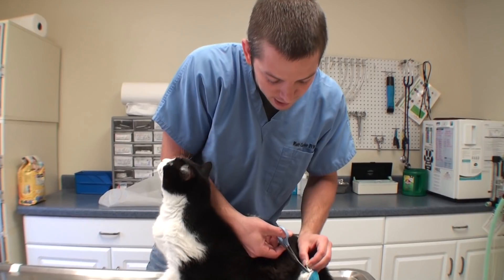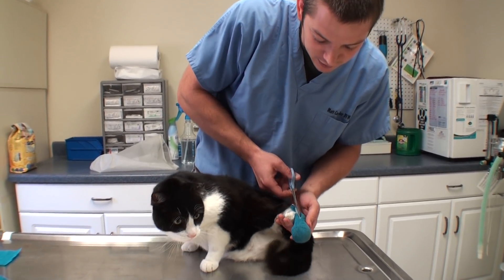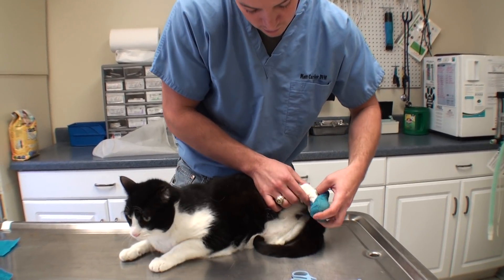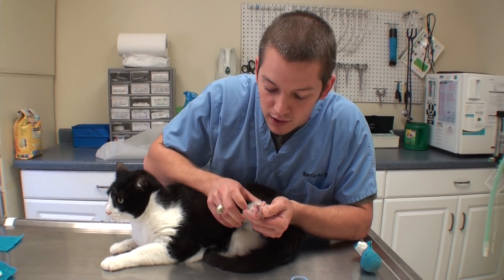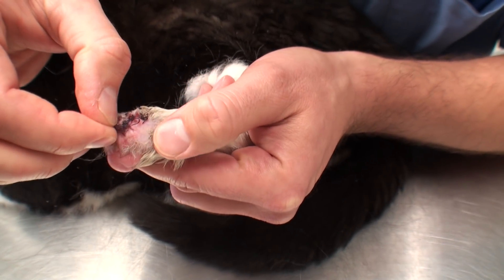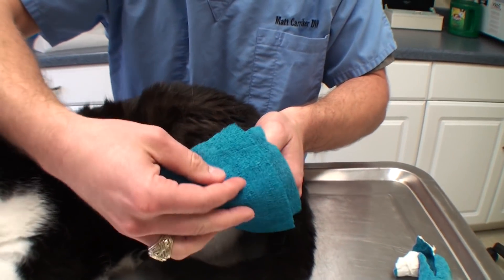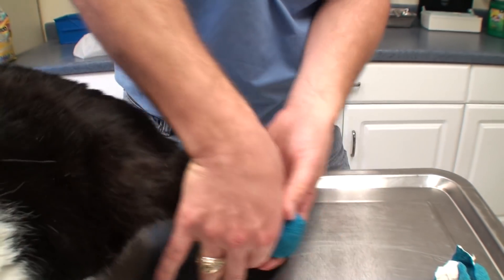We tried leaving it open so it can dry and not get infected, because we had trouble with infections before. But I think this is actually going to work this time. We're doing his bandage change today — it's been almost two weeks since surgery, but we're just not taking any chances, so we're going to keep doing this until the stitches fall out. His name Stitch really fits. It all looks like it's pretty close — there's a little bit of scabs but these stitches are getting ready to fall out. It looks like we finally made some headway. I'll pull those stitches out soon and I think we finally fixed his foot.